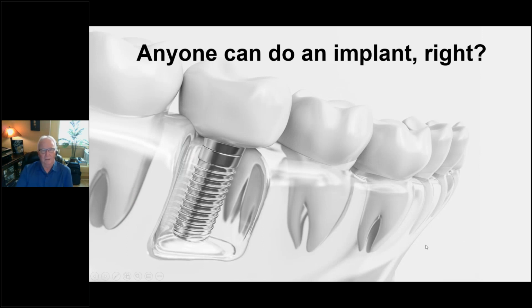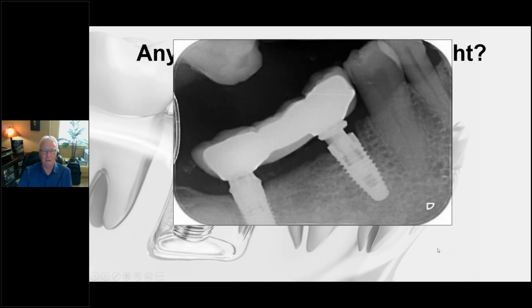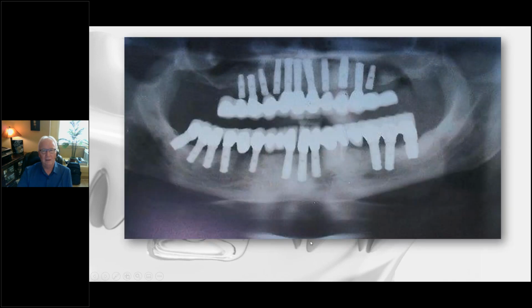So here we are. When you get these beautiful drawings, this is probably the sexiest image I've ever seen of a stylized implant in a space for it. Anyone can do an implant, right? I'm not so sure. This is stuff I took off the internet, just some examples. They haven't even imaged all this prosthesis, so we can't see what's going on here.